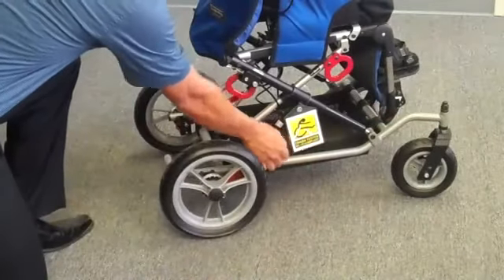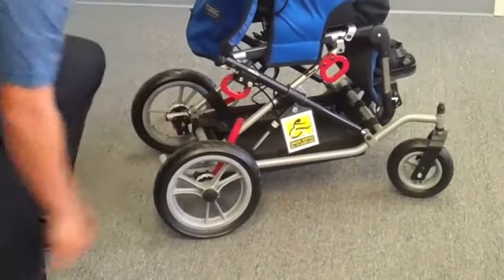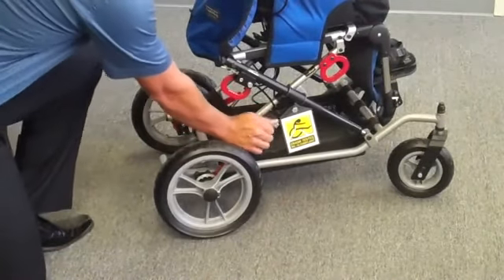To engage your brakes, simply pull on the lever. To disengage, simply push away from you.